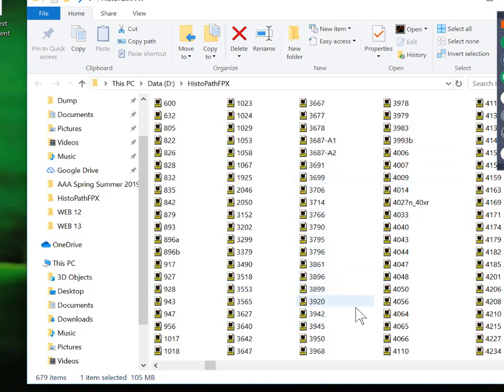Oh, I'm sorry, 3795. I'm a little dyslexic today. 3795 is over here. And let's hope that the microscope is working. There we go.